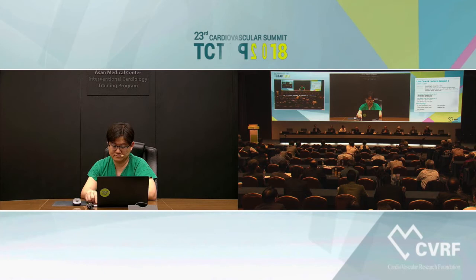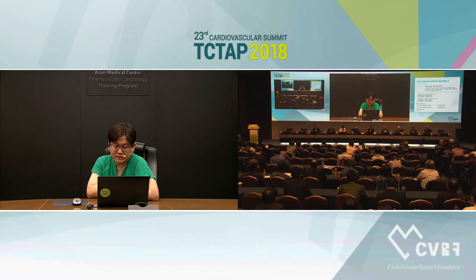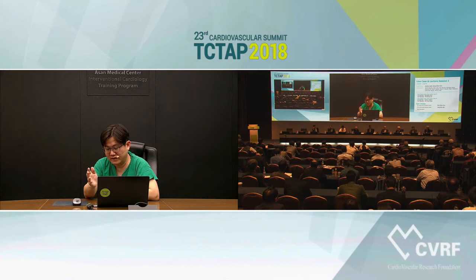Thank you for the comment. Dr. An, do you have any additional comment on that? Yes, I fully agree with your opinion, but we have to know that the FFR cutoff value of 0.80 is a very strict cutoff value. Yes, clinical judgment is very important, but sometimes we need a very objective scale, which says this is good, the other is bad. Then we have to fully understand this nature, and on the basis of this nature, we need to make further clinical judgment.